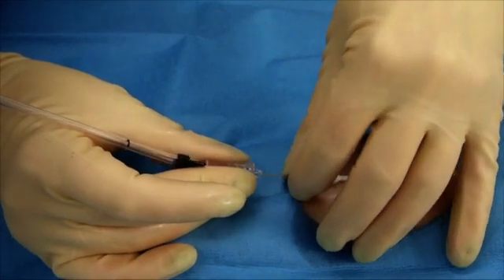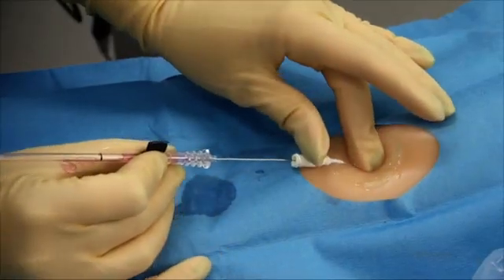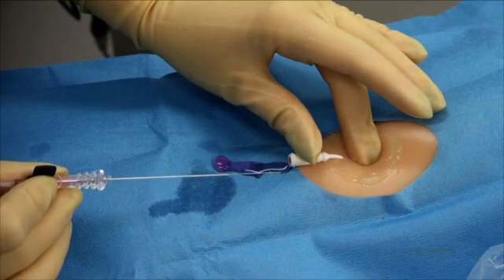Advance the catheter forward over the spring wire guide. Hold the catheter in place and remove the spring wire guide assembly. A pulsatile blood flow should be visible at the end of the catheter, which indicates a positive arterial placement.